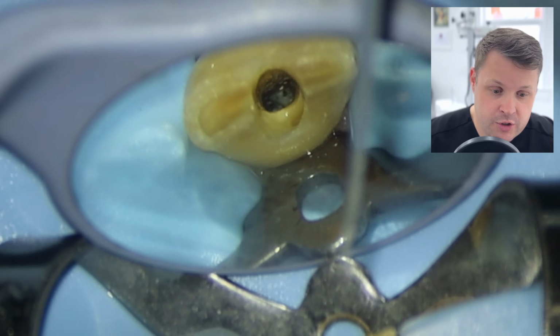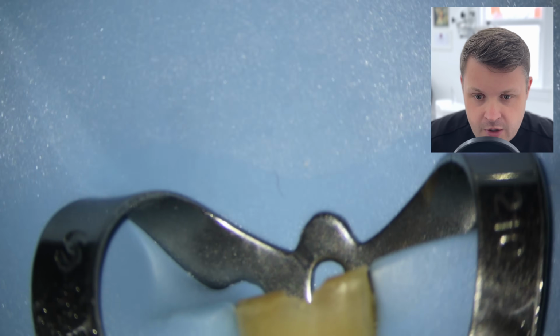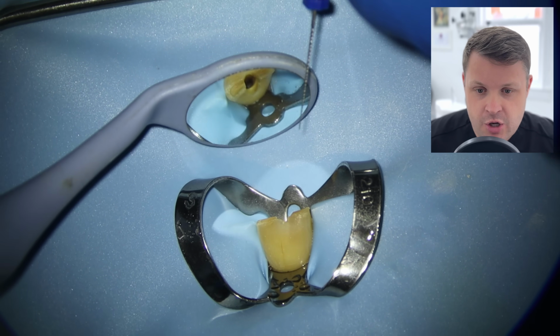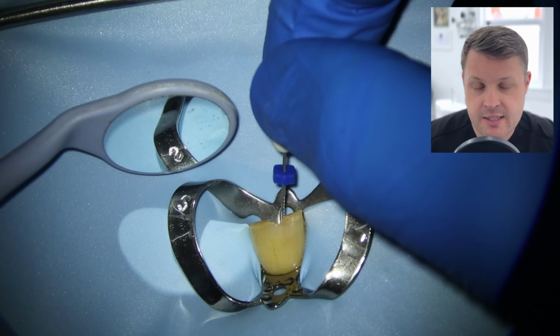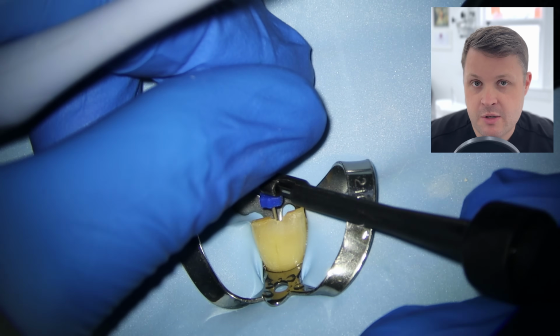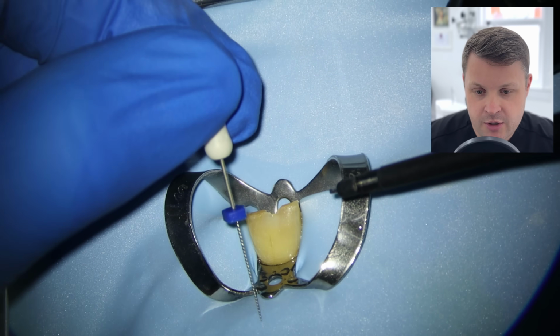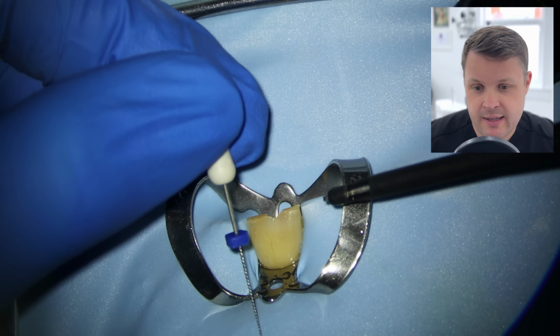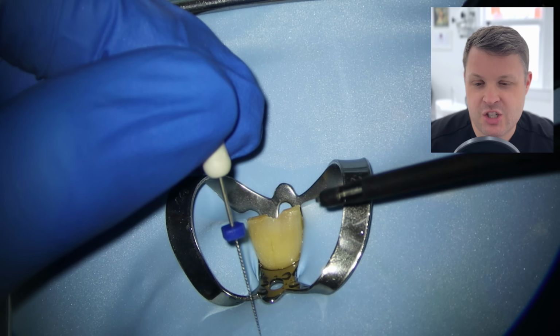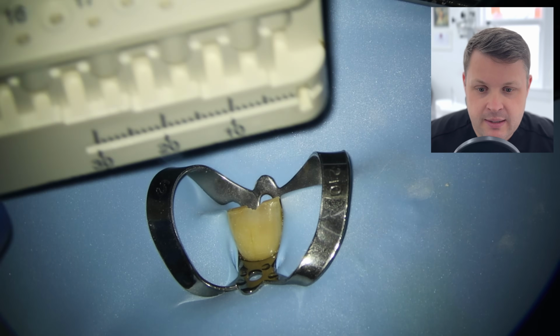So I do want to just check the orientation or the length of this tooth. I'm going to use a size 15 K file, which is probably one of the best files to use. What occurs to me is that this is really, really short, which is hitting 0. When we marry up the file to the external surface of the tooth, I can see that it is super short, and it's measuring 16 millimeters.